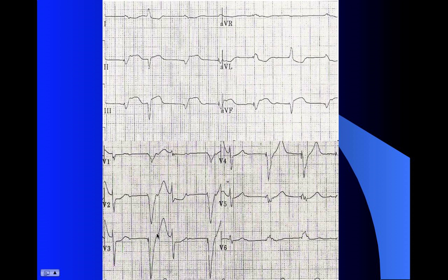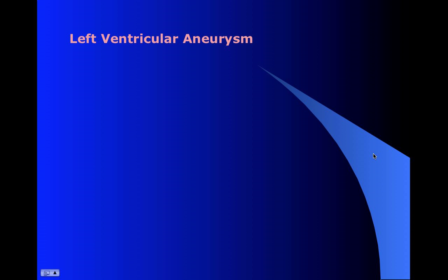Look at your anterior leads. These are not too alarming maybe. But when you look at the overall pattern, we're again thinking, is there an inferior MI here? And yeah, there really is. So you don't want to be caught off guard by these paced rhythms. These people will still have the same problems everyone else does.